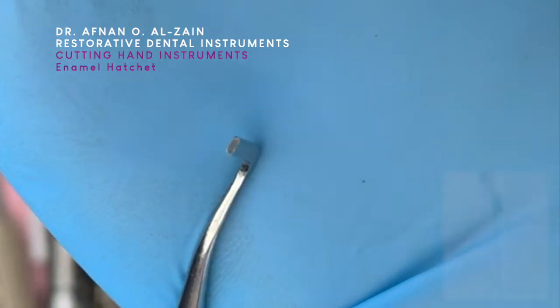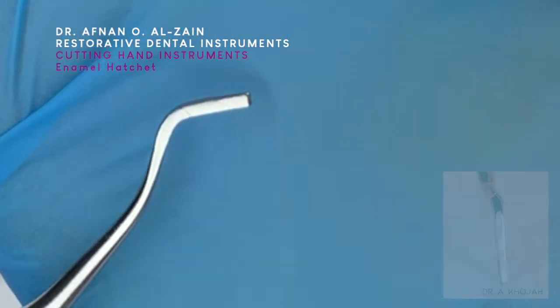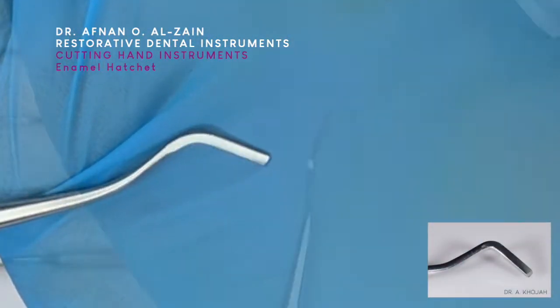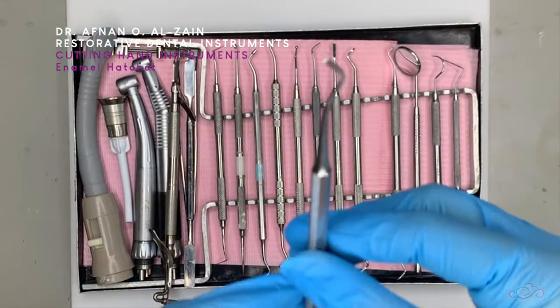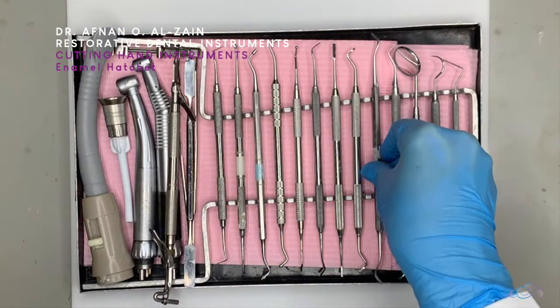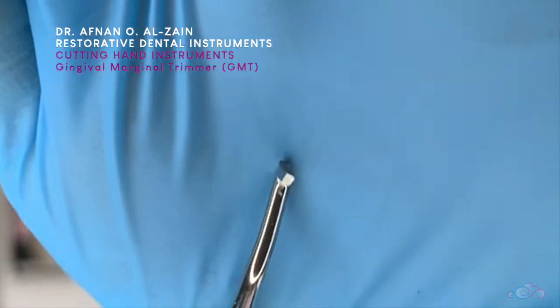After that we go to the enamel hatchet. We can see how it is at a right angle. It's also usually double-ended, and it's used to cleave the enamel walls and floors and remove unsupported enamel. It is mainly used for the walls.